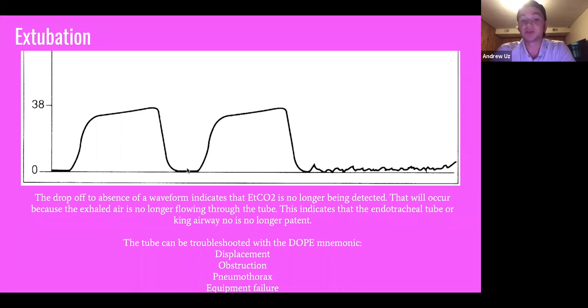Remember, because the upstroke is on the exhalation, you're going to see that when you let off the bag, and then as you squeeze the bag again, you're going to see that next dip, and so on.